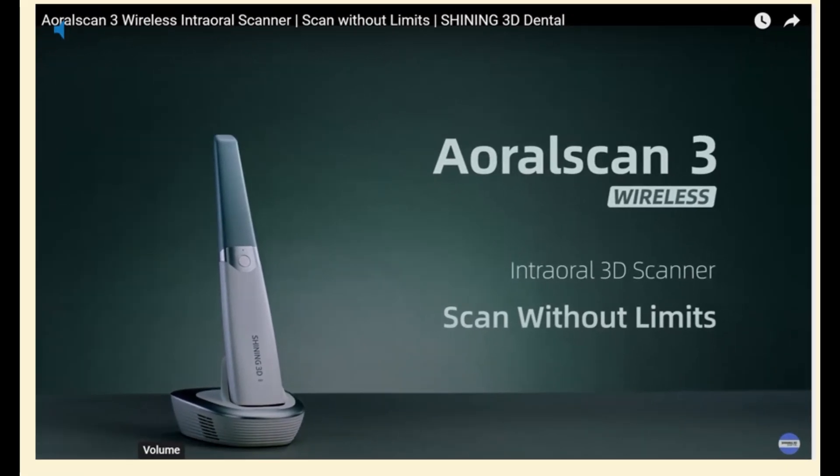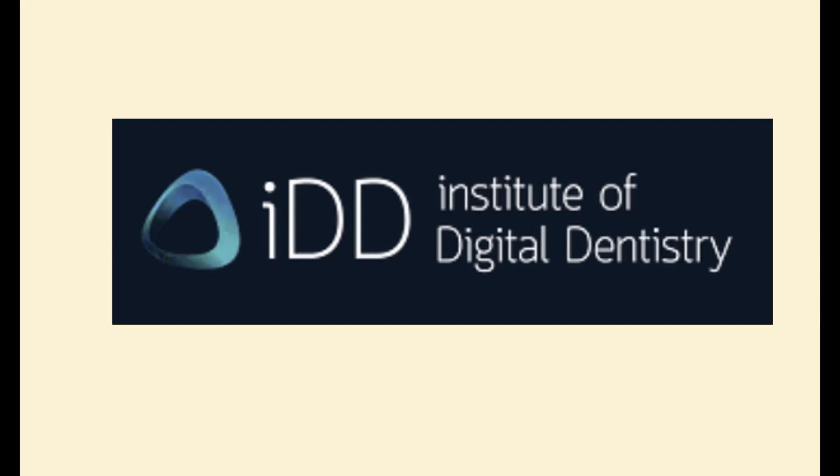Now for the unboxing. In 2024, the AOS 3 wireless is not a new release technology, so I looked around for existing unboxing videos to emulate. I found quite a few, but one in particular was outstanding and is exactly how I would have presented this. It is a non-verbal video, so I've decided that I will review and commentate it. The video was made by the Institute of Digital Dentistry, a group of technophilic New Zealand dentists. I love these guys.